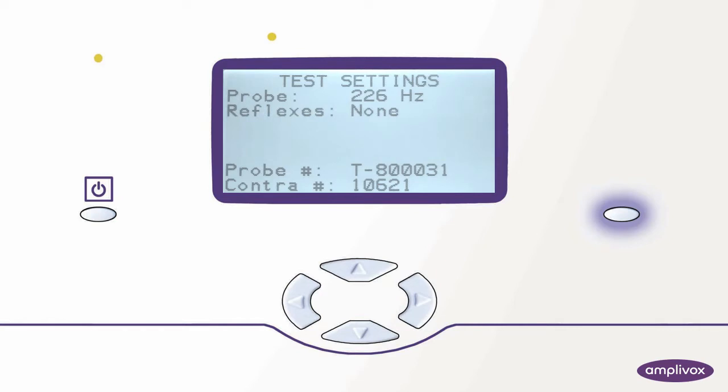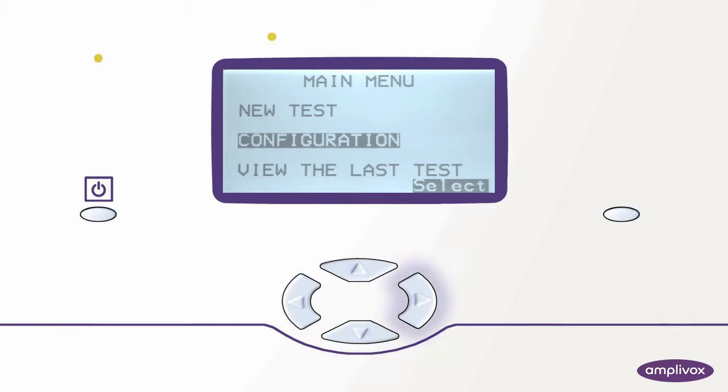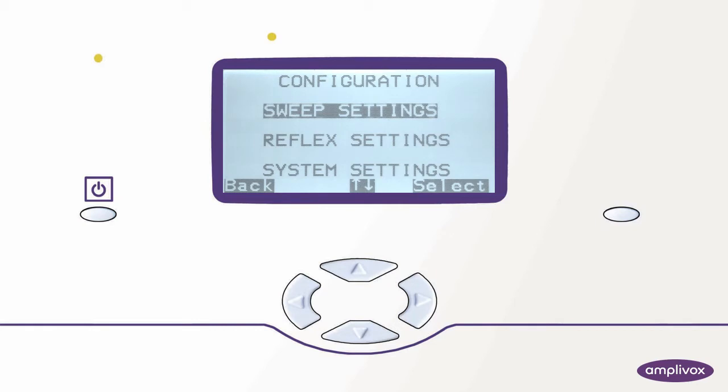So let's get started and activate our ipsilateral reflex test. From the main menu we press the down key once to move to configuration. In order to access the configurations we select the right key and we will be brought to all our instrument configurations.